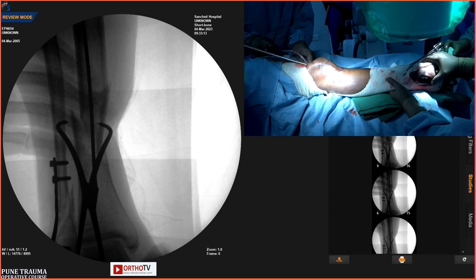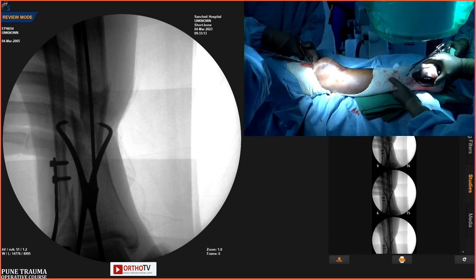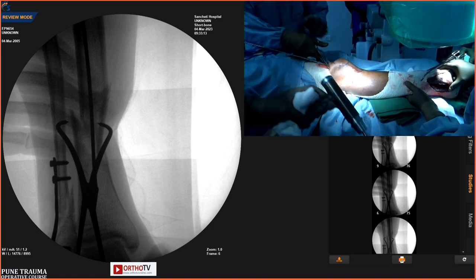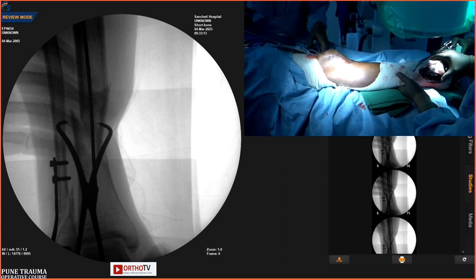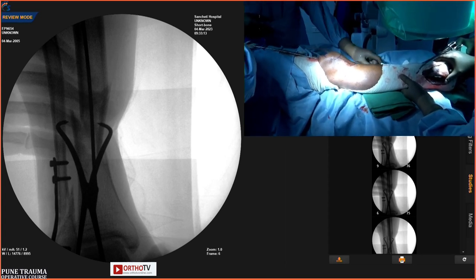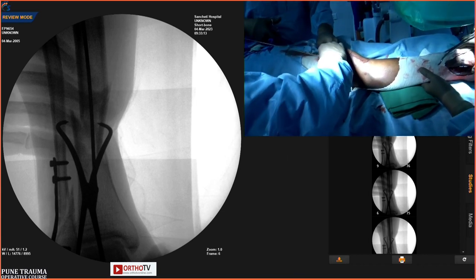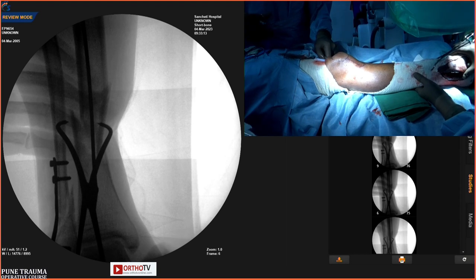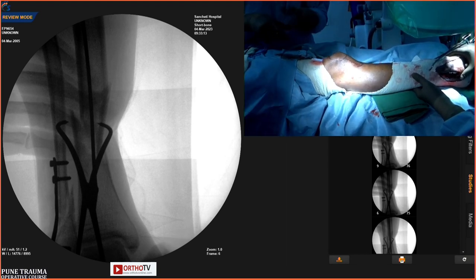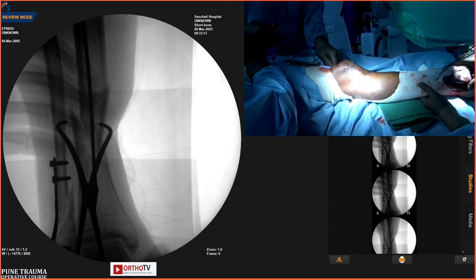Sir, why do we have to use a reamer in the distal segment? We can ream up to the isthmus with a straight guide wire and just pass the nail. Reaming the distal fragment will displace the fracture if it's there.